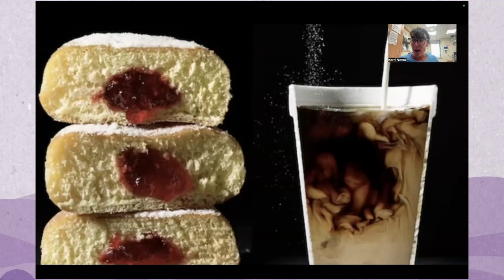So how do we do that? As I mentioned, we look in cross-section. So look at all the rich information you glean when you divide something in half so you can see it in cross-section. You see the richness of the donut, you see what's in the styrofoam cup. It's the same thing when we do a CT scan or an MR enterography or even an intestinal ultrasound. We look at the bowel in cross-section, and we look at the very important mesentery that surrounds the bowel, both of which we cannot see on endoscopy, and we do not get an appreciation for with blood work alone.